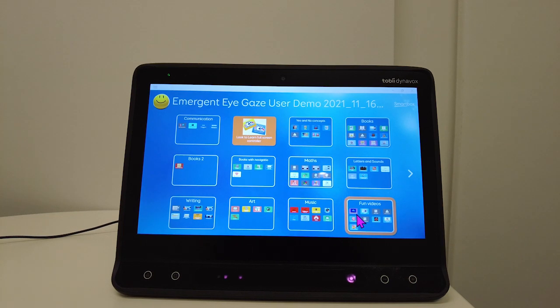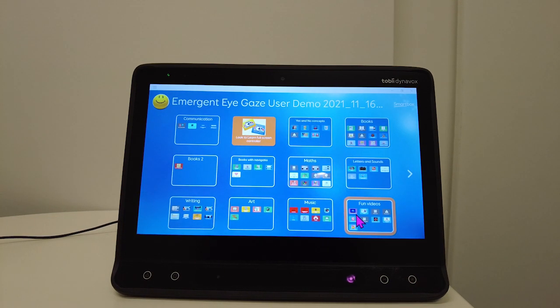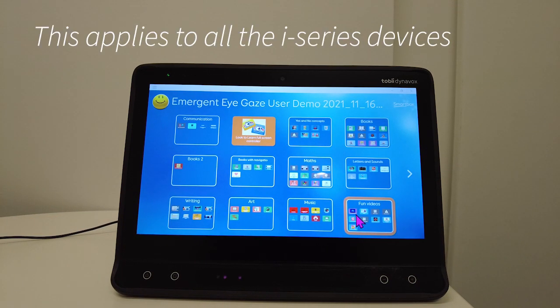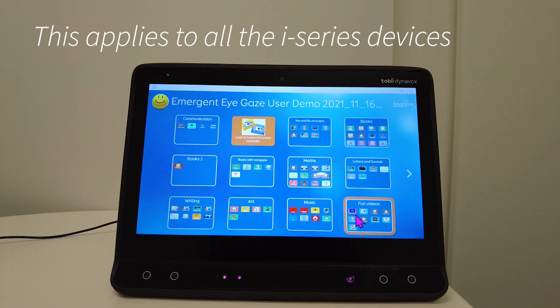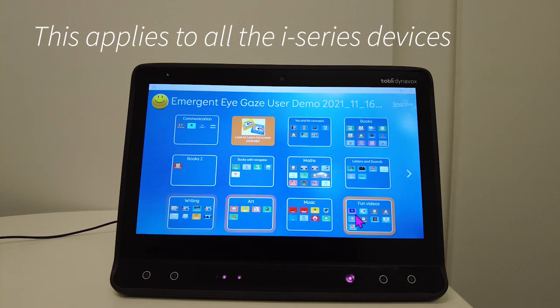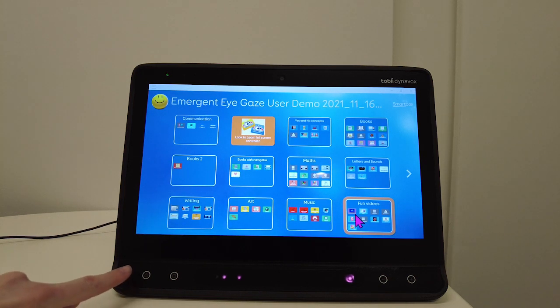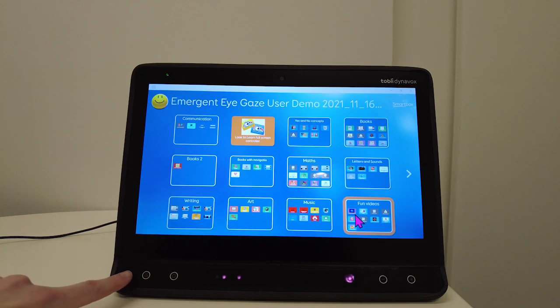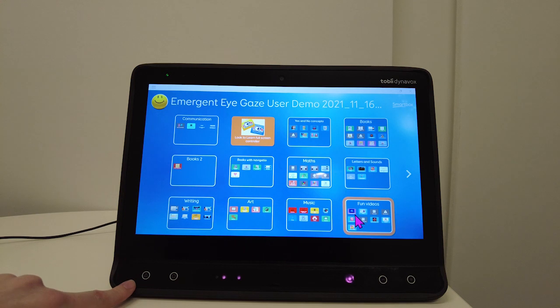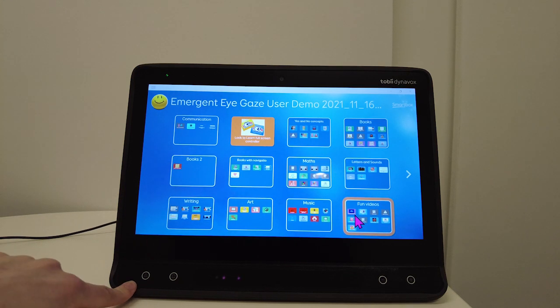If you're using a Tobii Dynavox i13 eye gaze device and you want to check the positioning of the user's eye gaze, another way you can do this is by using one of these shortcut buttons at the front.